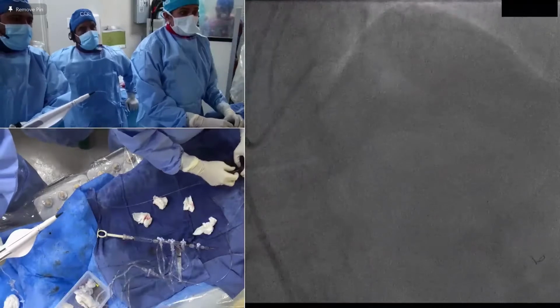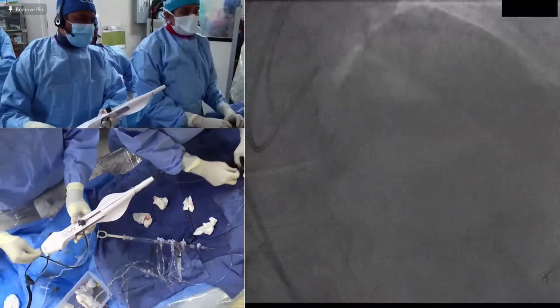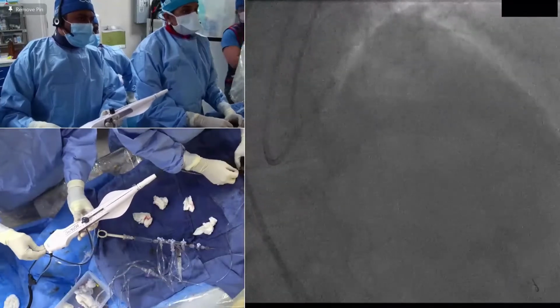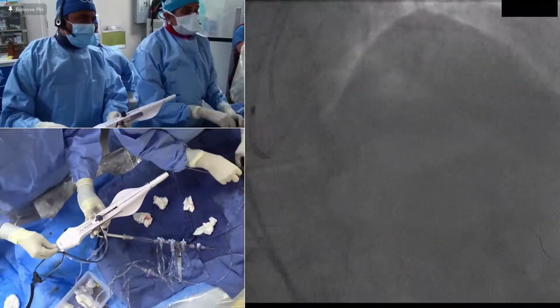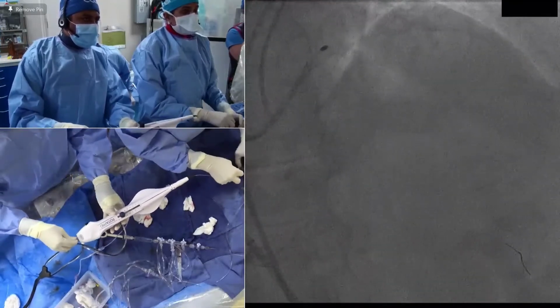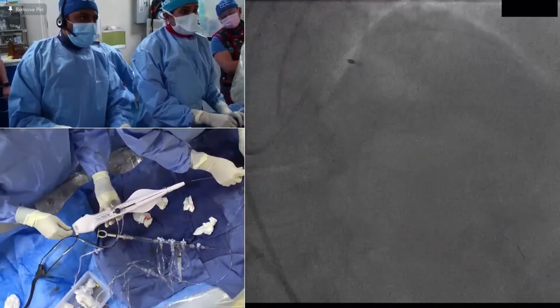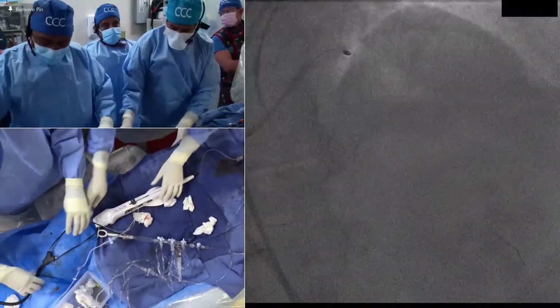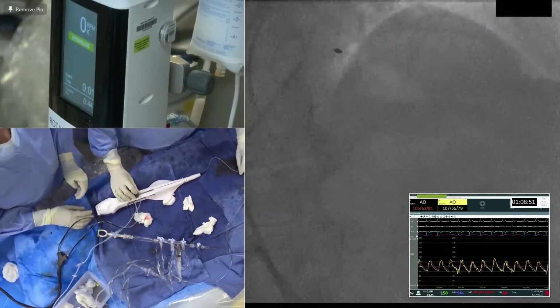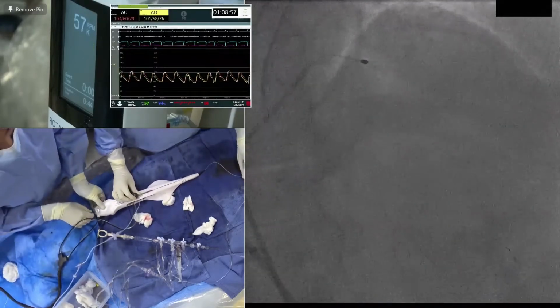Jackie? No, for Tamis. Yeah, go ahead. Okay, thanks. So I think that a lot of the concerns nowadays with rotational atherectomy are no longer going to surgery. They're easily fixed with the covered stents, et cetera. I think the issue is more logistical, like Artie said, which is really you're at a lab without a couple of attendings available to help out. Somebody's putting the impella in while somebody else is doing the covered stent. So I think it's more a logistical issue in terms of having the support you need from a nursing and an attending standpoint.